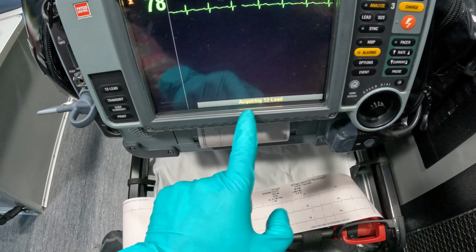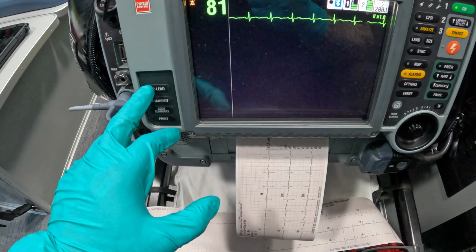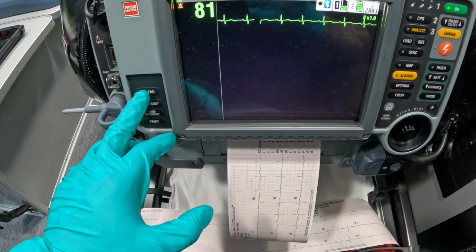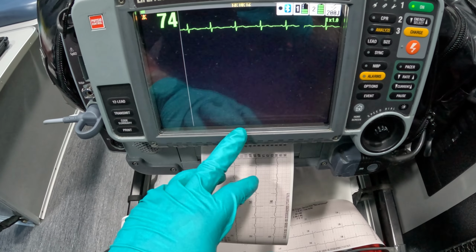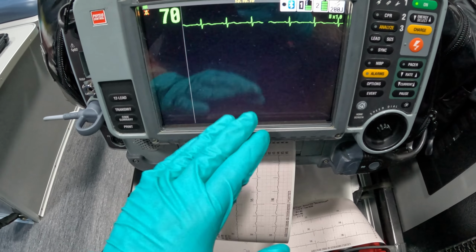Essentially, we talked about the anatomical landmarks, palpation, application of the limb leads and the precordial chest leads, and the buttons. The buttons you're going to need are all on the left-hand side: the print for your three lead, and then the 12 lead where you place the patient's age and sex. Then you acquire. If you see it says noisy data, it's probably the patient has chest hair or the patient is moving. So it's very important you tell the patient, sir, please don't move. It's very important we get a good tracing.